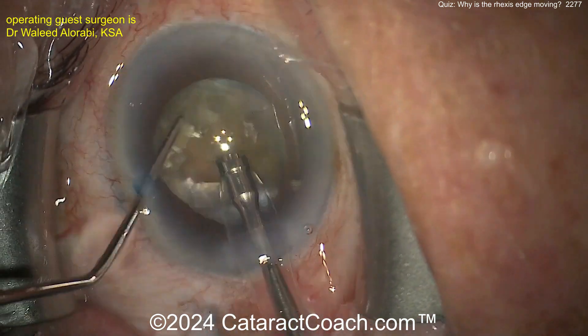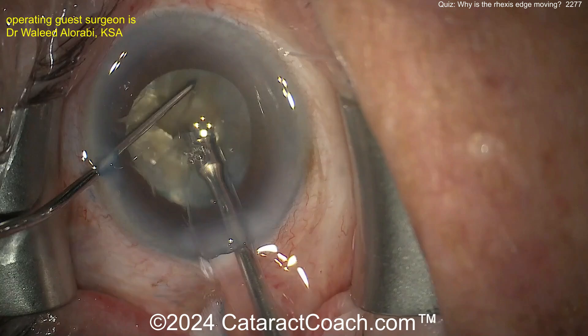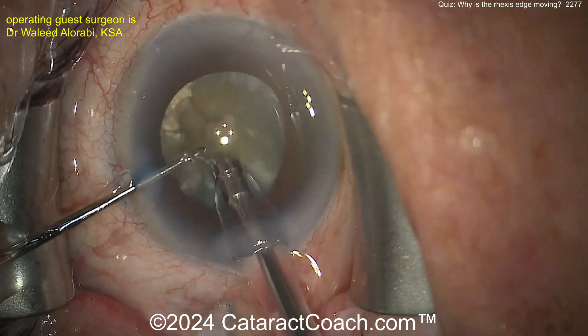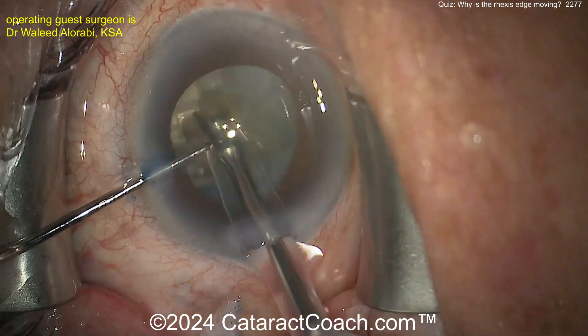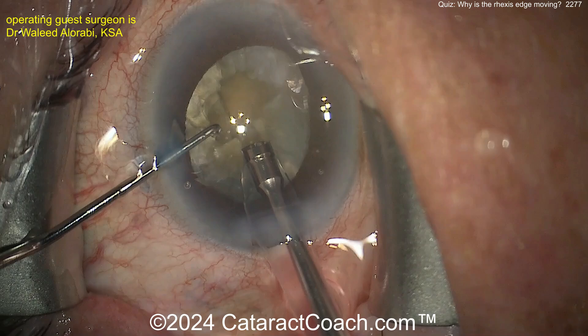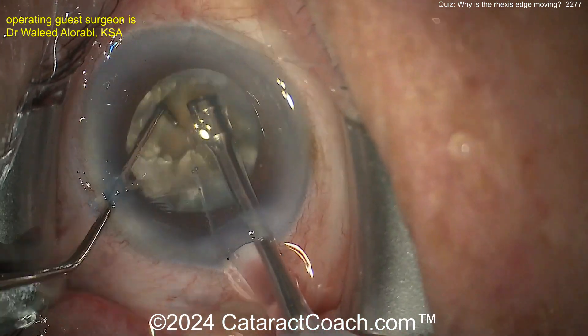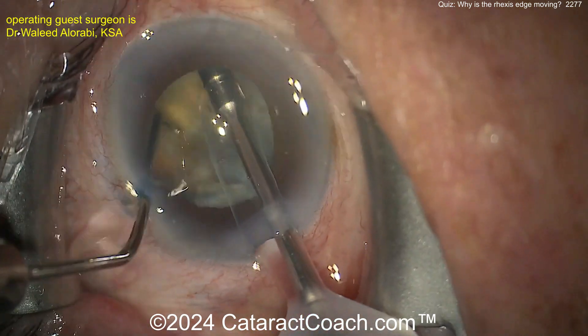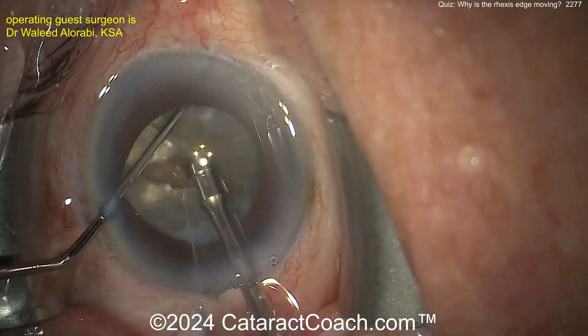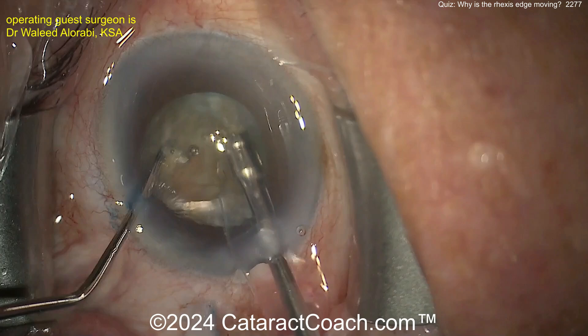Now doing the surgery — here's some chop technique to divide the nucleus into fragments. A little groove maybe to help split it a bit more. A couple of chops maybe didn't fully propagate, so you can groove a little more to help achieve separation of the two halves. There we go — it looks pretty good, everything looks reasonable.